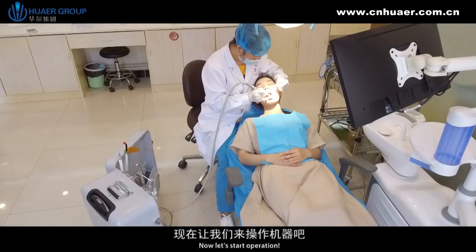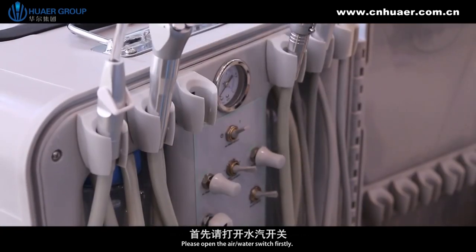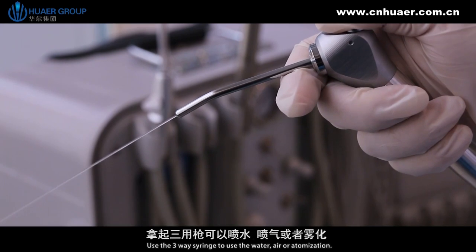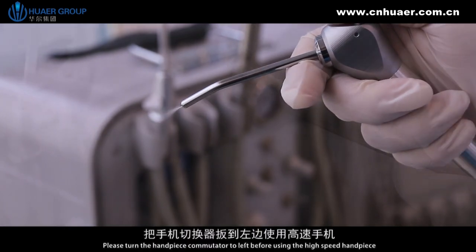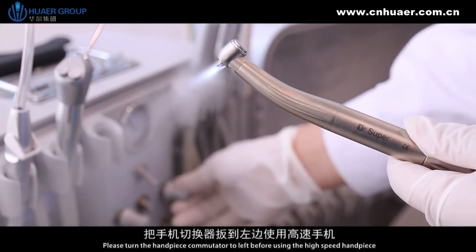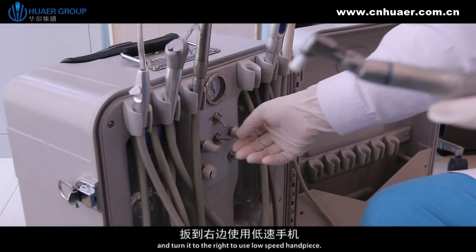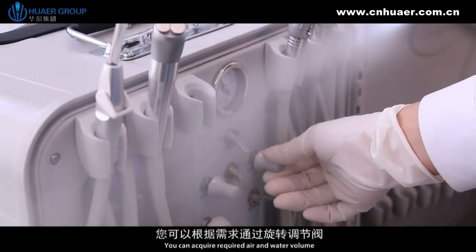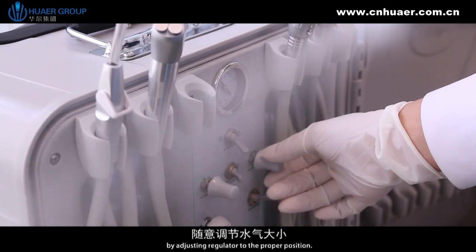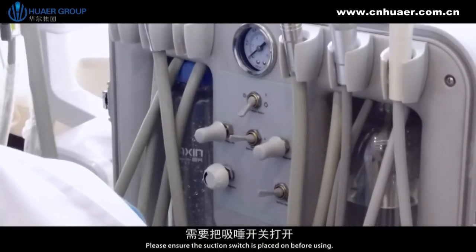To start operation, please open the air or water switch first. Use the three-way syringe for water, air or atomization. Please turn the handpiece commutator to the left before using the high-speed handpiece, and turn it to the right to use the low-speed handpiece. You can acquire the required air and water volume by adjusting the regulator to the proper position. Please ensure the suction switch is turned on before using.